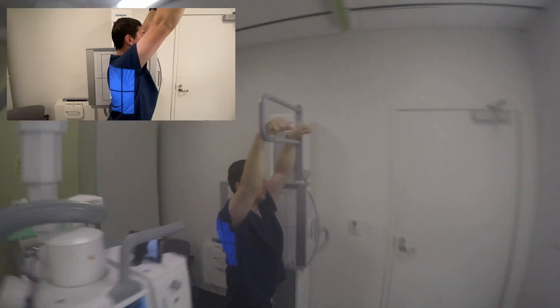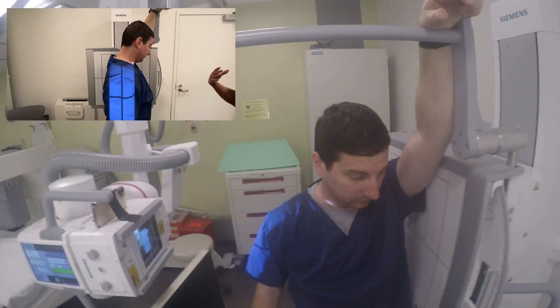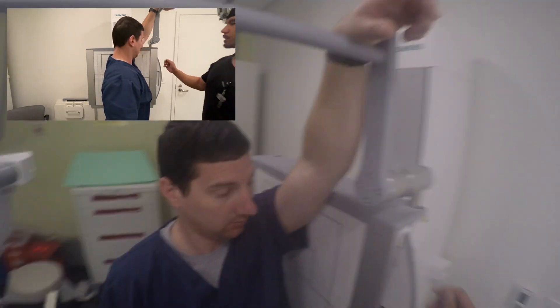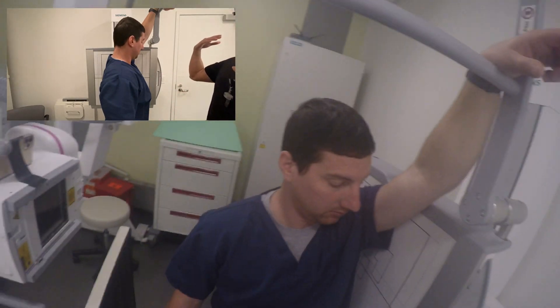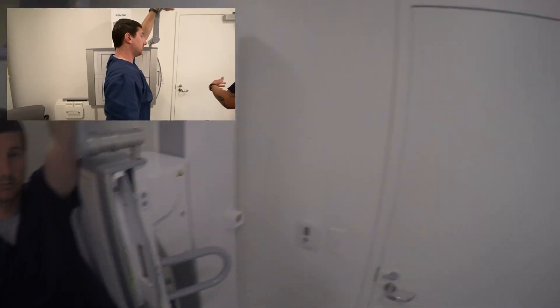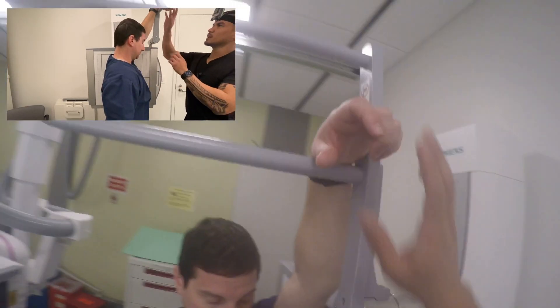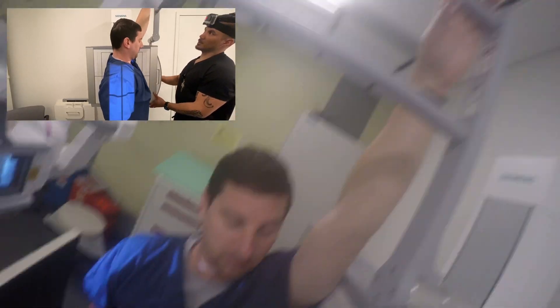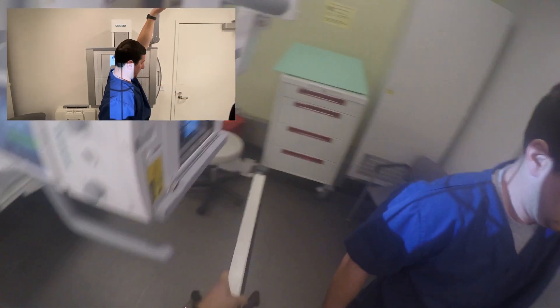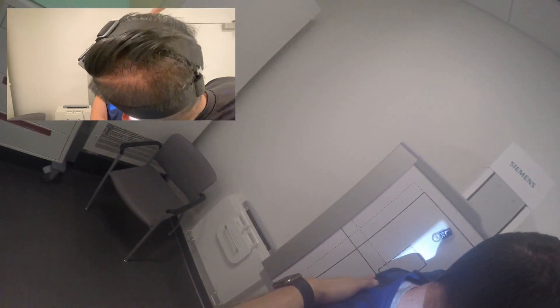Okay, so we're going to leave your left hand on the bar there, we're going to drop your right arm down to your side. I always ask my patient if they have any issues with their shoulders because we're about to give them a stretch. I demonstrate what I'm going to have them do because this is an odd position and most tend to tilt their body to their right. We want to make sure that the head and spine are in a true lateral and vertical position. I have them leave their arm closest to the bucky above their head, hand on the bar. Other arm directly to their side, not rolled anteriorly or posteriorly. Then have them reach down, again keeping their head and spine in a true lateral and vertical position.